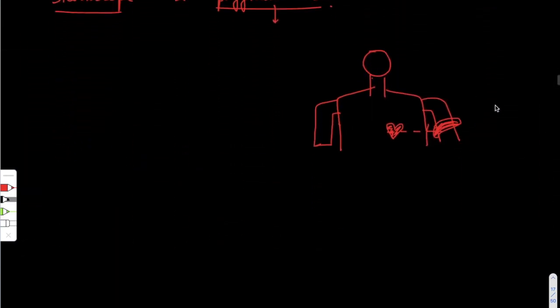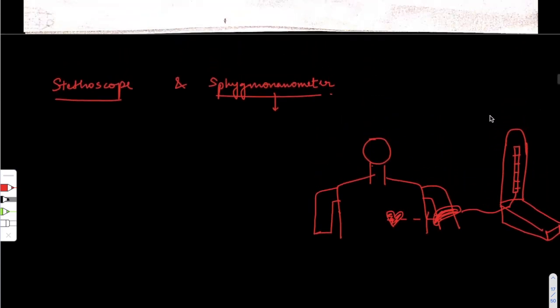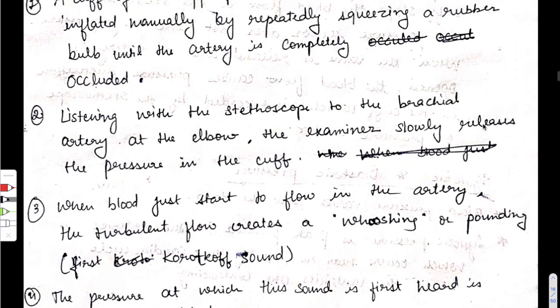So it is attached to a manometer. You have seen the instrument like this: here is the pressure monitor, and here is the box. It is very simple.